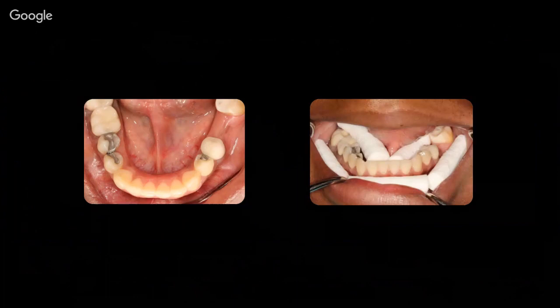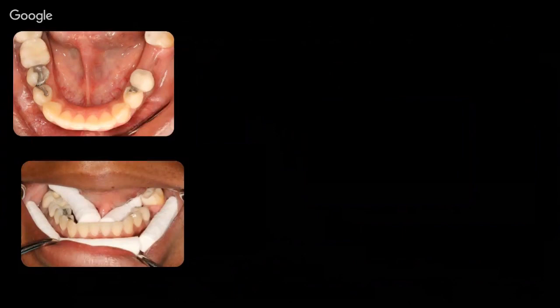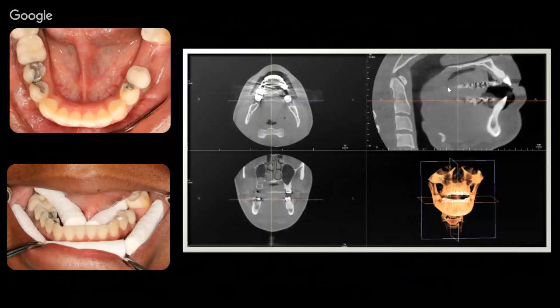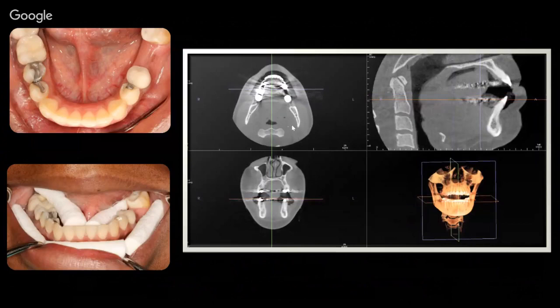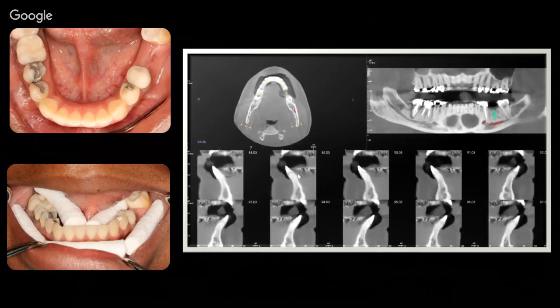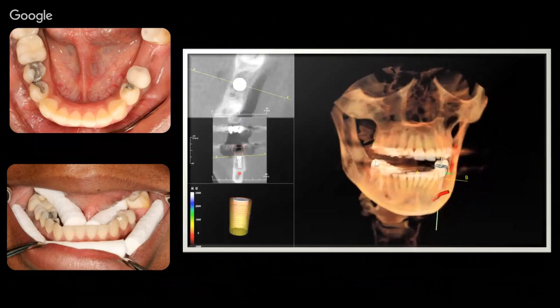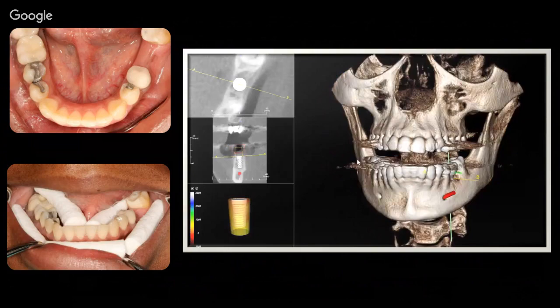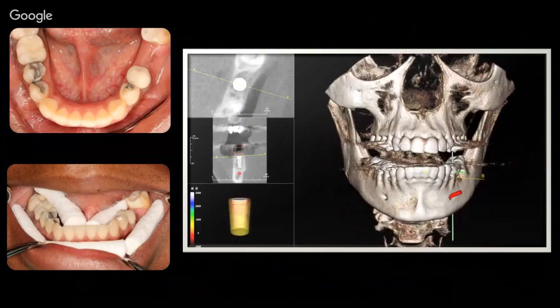How do we take the patient out of occlusion and create an air pocket around the dentition? By using simple cotton rolls. Pack a series of cotton rolls buccal and lingual around where the cheeks, soft tissue, and tongue are. When you take your image and go through radiological slices, you see the roll of the cotton roll sufficiently around the patient's dentition with the tongue away from the arch. You can see the mandibular structures easily all the way around, the gingiva, and the oral structures clearly defined. Even with a patient who has extensive restorations, it greatly enhances the ability to align STL files.